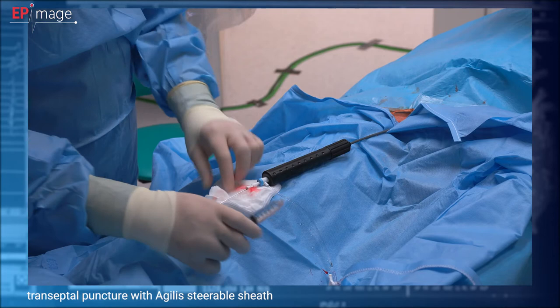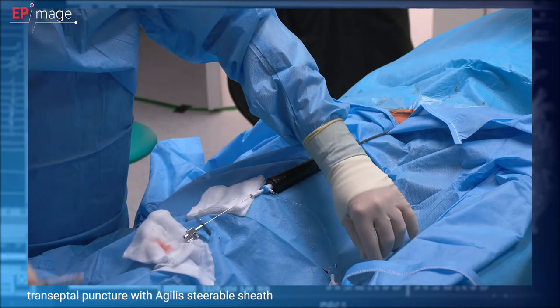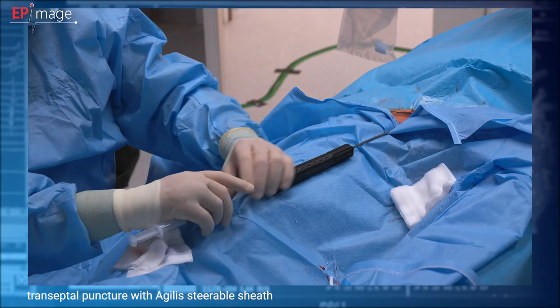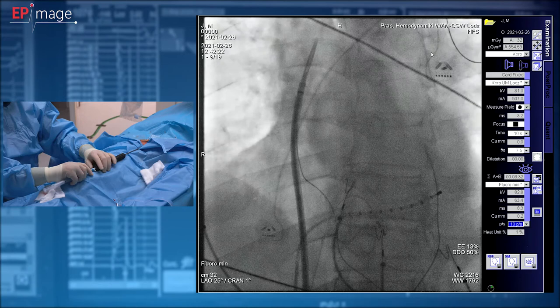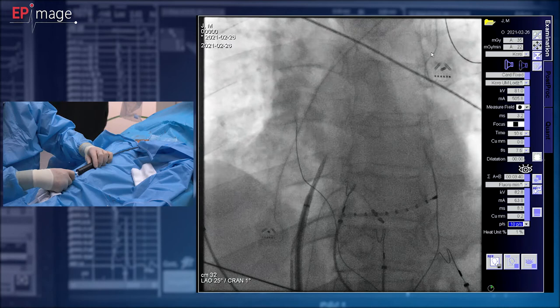It's a bit more challenging to perform transseptal puncture with Agilis, but I've been using this set for years now, and in most cases I don't need to use a standard approach. So for single transseptal puncture, after the puncture, I'm already in the left atrium. So now I give some dye contrast, and with a standard approach, we are just moving down along the septum.